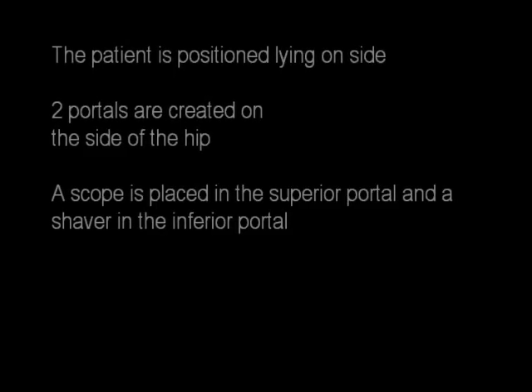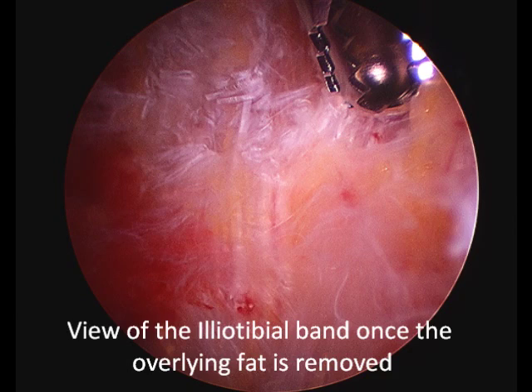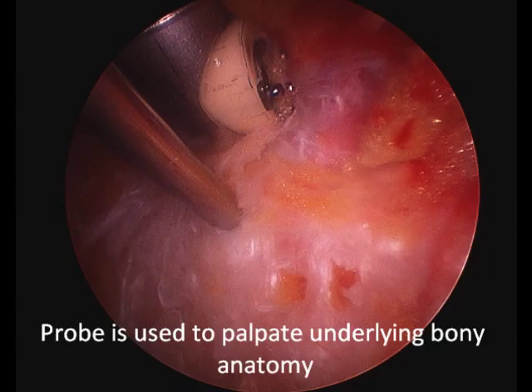The patient is positioned on his side, portals are created, and the scope is placed. This is a view of the ITB once the fat is removed. Next, we're showing probing of the underlying bony anatomy.